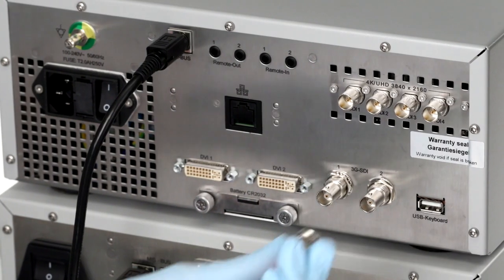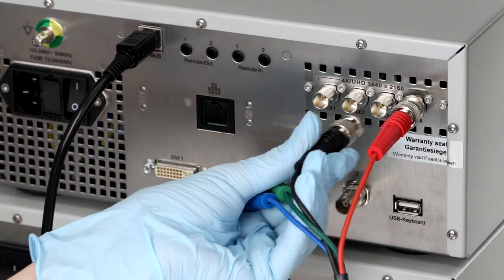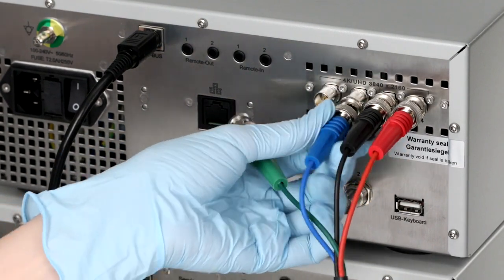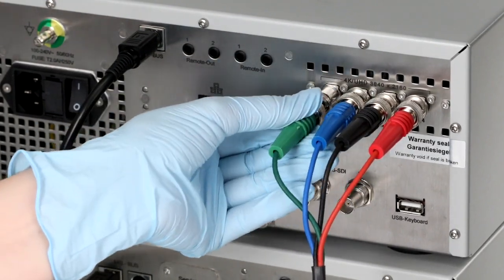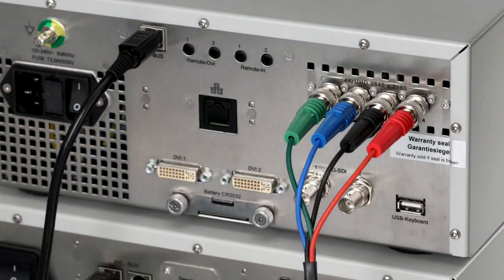Whether you have one or multiple monitors, you'll need to start by connecting the four 3G SDI cables to the four 3G SDI outputs for 4K UHD on the back of the CCU. If you have multiple monitors, they can be connected and used simultaneously with the Elevision 4K Plus platform. Remember, you will need a second 3G SDI cable to connect your secondary monitor.